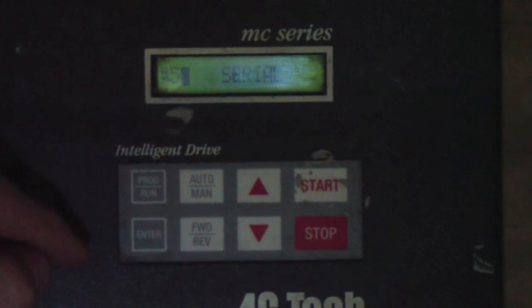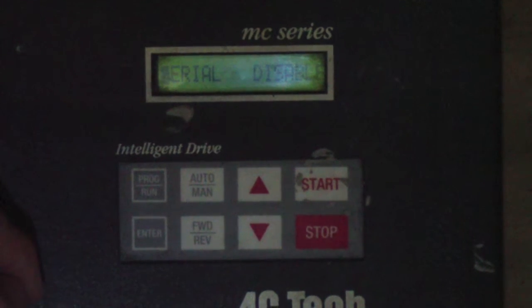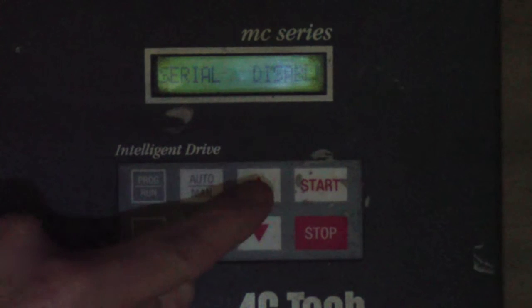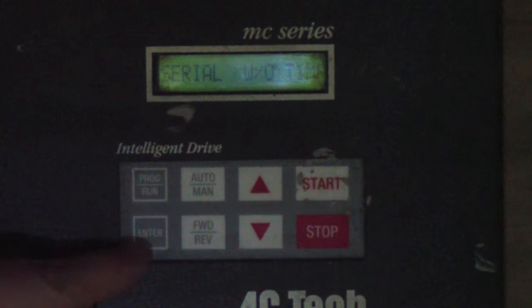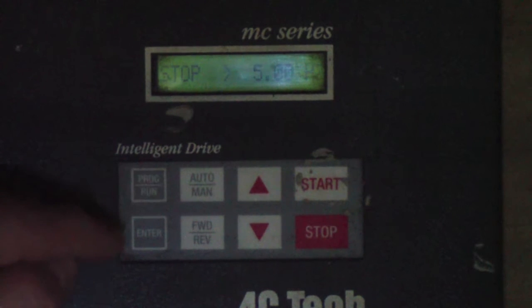Parameter number 57 reads Serial. Hit the Enter key. It's letting us know that Serial is currently set to Disable. Hit Enter one more time; the cursor will go over to the right side. Hit the up arrow twice and it'll read Serial W/O Timer — without timer. Hit Enter, the cursor goes back to the left, then hit Program Run.